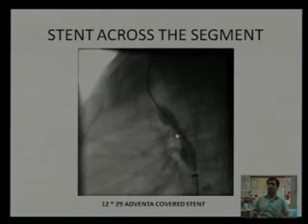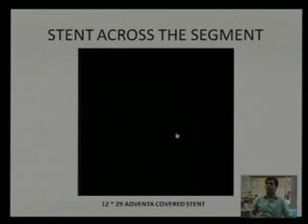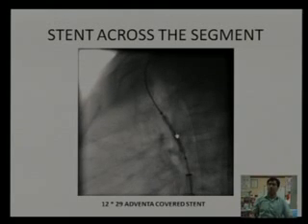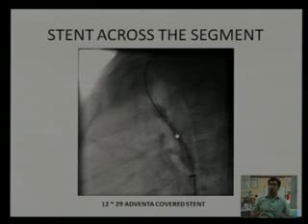So we thought we'll reduce at least one, and in a graded way, later we can tackle the renal artery, and we can tackle the descending thoracic aorta as well as the abdominal aorta. So with the same view, we thought we'll go with the covered stent. As you know, there is tortuosity here, there is more risk of dissection, and the PDA ampulla is there with calcification. We thought it's better to go with the covered stent.